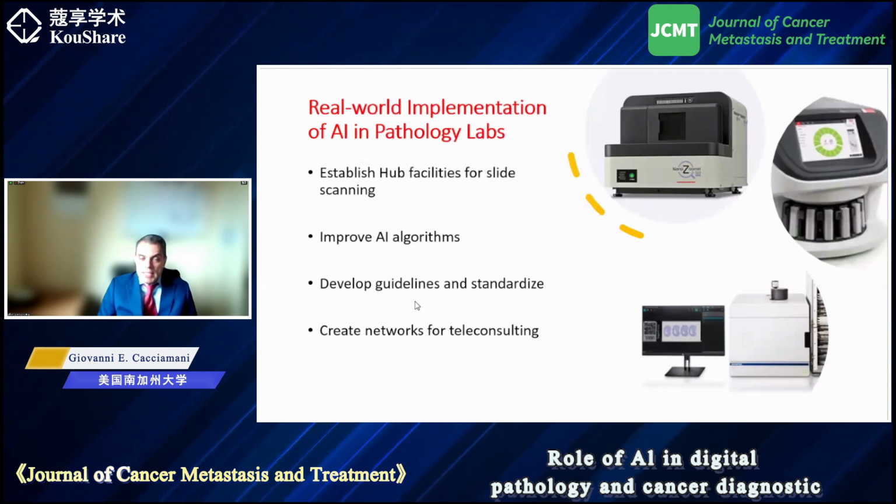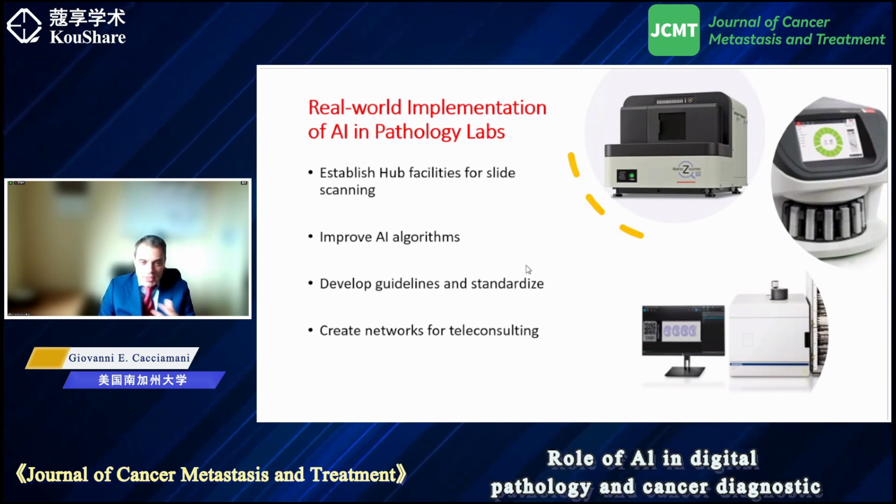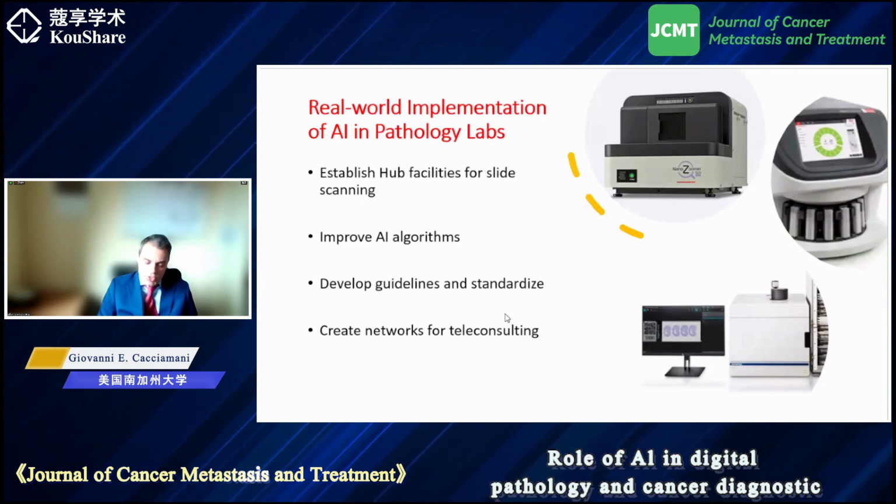Very practically, as I said, you need to buy, first of all, a scanner. It can be an automated scanner capable of managing 1,000 slides per day, but it can be even a simpler system that should then be paralleled by an artificial intelligence algorithm. So you should be careful when you buy the system, also to check what is offered and can then be applied to this system. Very importantly, we must develop guidelines and standardization and create the network for telemedicine.